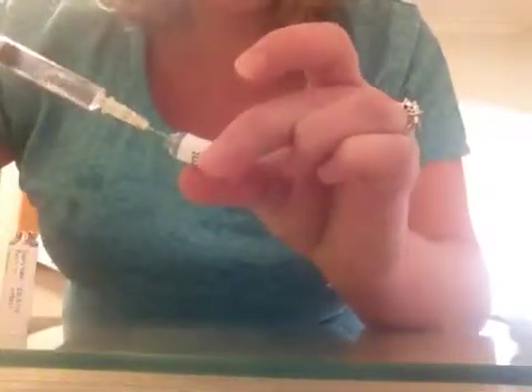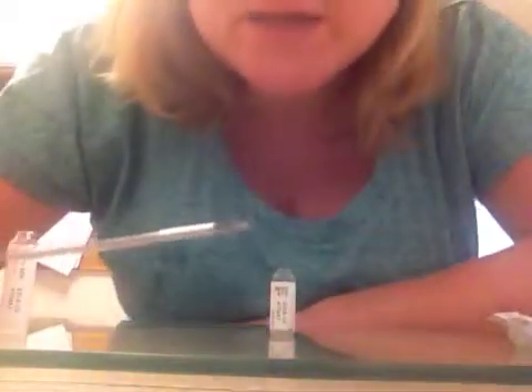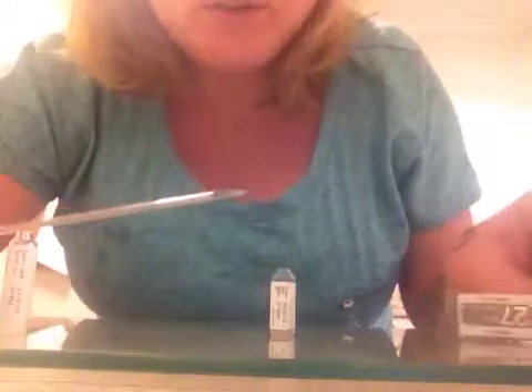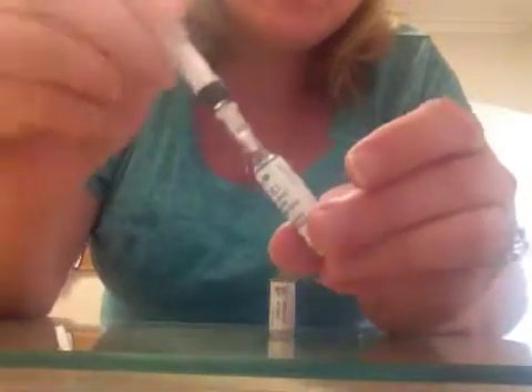I'll take the cap off and attach it — it just pushes on. It is fiddly because it is in a glass vial, so you just tip this in and draw up the fluid. Make sure you do get two needles. This is a big needle and it would hurt going in. What you do is push the fluid into the powder and it automatically dissolves — it's quite good. Just give it a little stir, and then draw it back up.